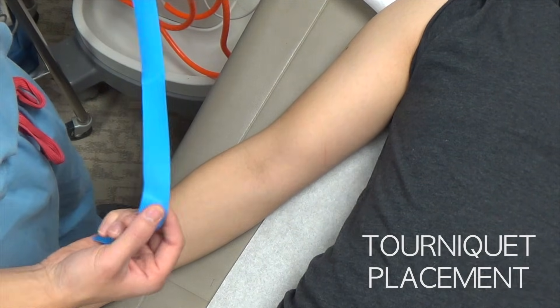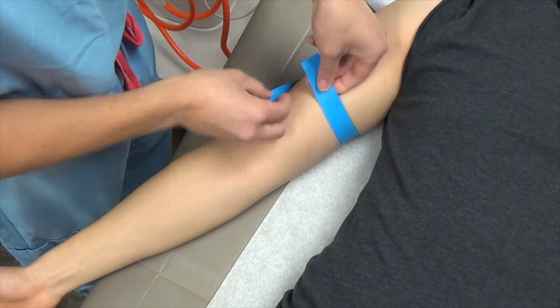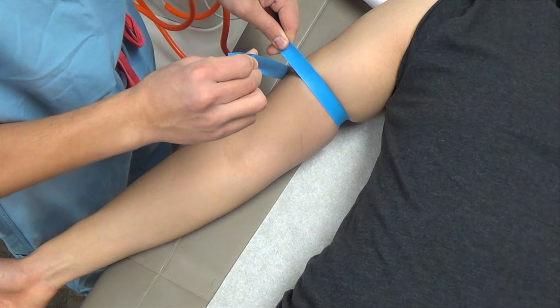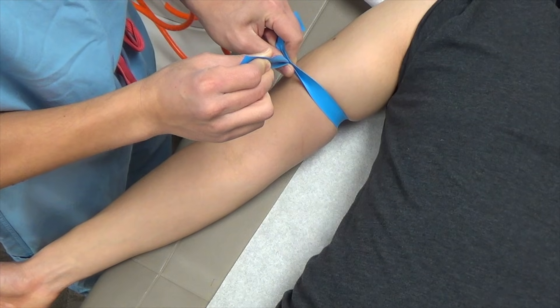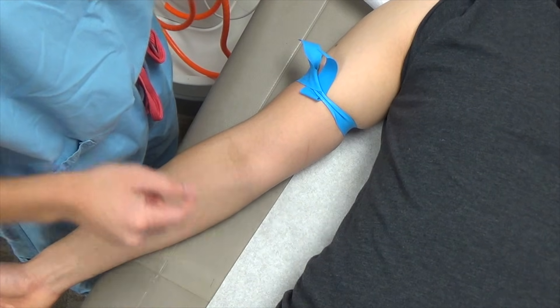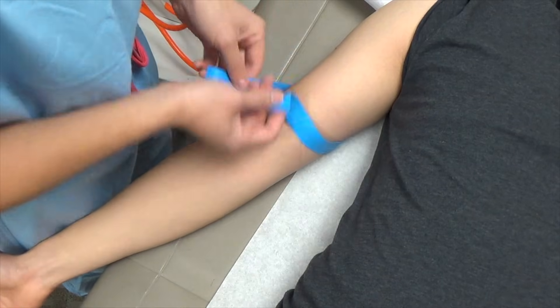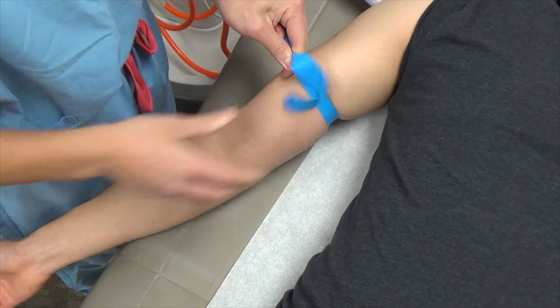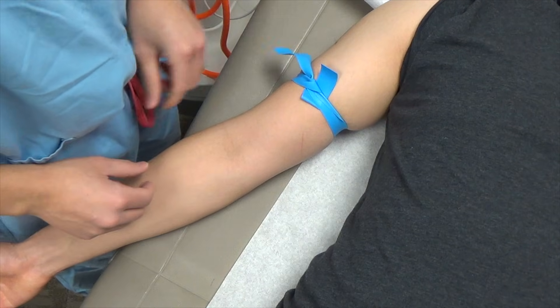The first step is placing the tourniquet. Put it underneath the patient and crisscross it. Pull up with your left hand, then your right hand. Hold the tourniquet at the crossection with the index finger and thumb of your left hand, then tuck it underneath with your right index finger and let it go. To release, just pull that end. Pull left, then right, crisscross, pinch with your left hand, tuck with your right, and let go — that gives you a good tourniquet.